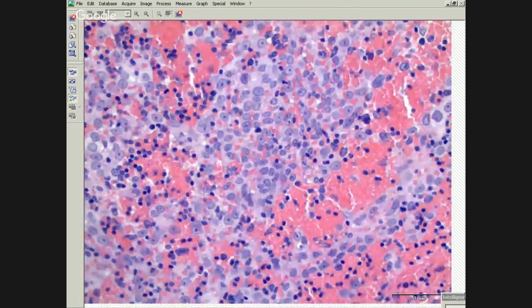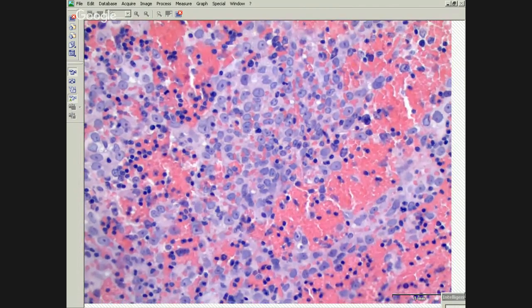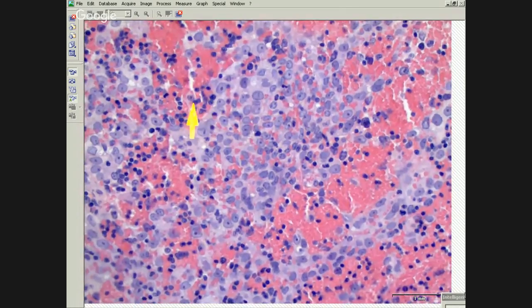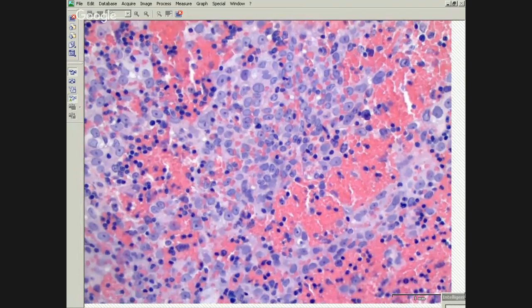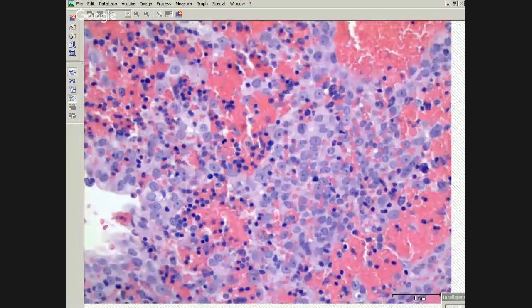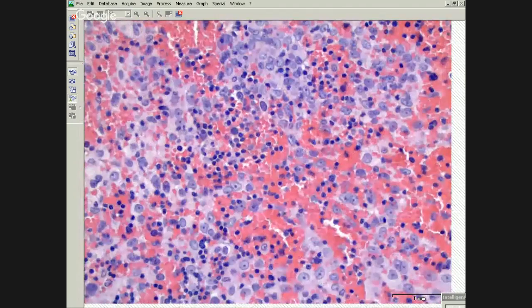Okay, but backing up our decision tree, we've got multiple nodules in the pleura. You've got these not too cytologically ugly epithelioid cells with lymphocytes in the background. Two components. Yeah, epithelioid and lymphoid. Okay, very good. All right, so this is a drop metastasis of thymoma to the pleura.